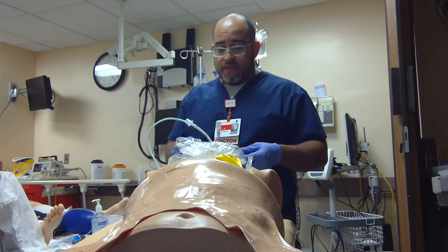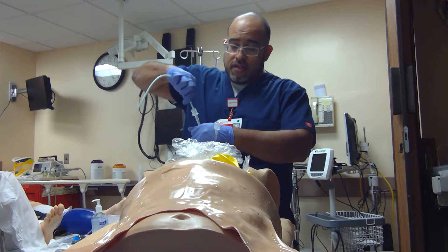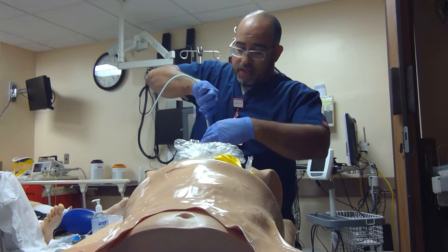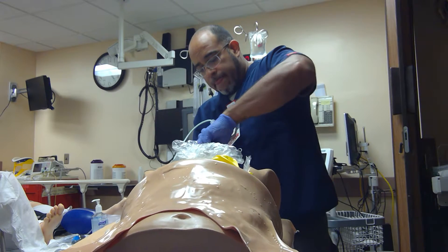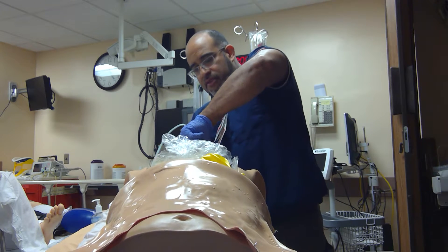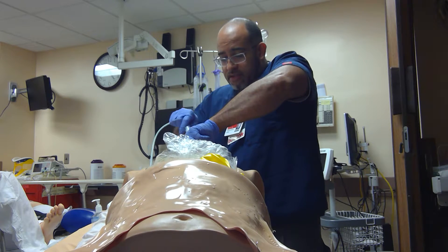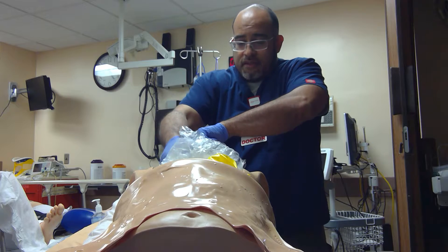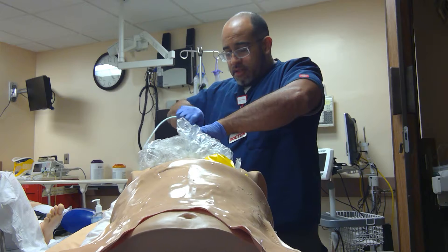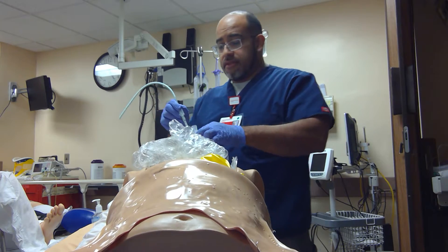I'm doing something crazy. Let's see if I can actually deflate this tube — I hope it doesn't dislodge. I'm going to go a little deeper so this tube can actually go deeper as well. It's such a tight fit. Oh my God. These are crazy MacGyver maneuvers — but it's not letting me pass.